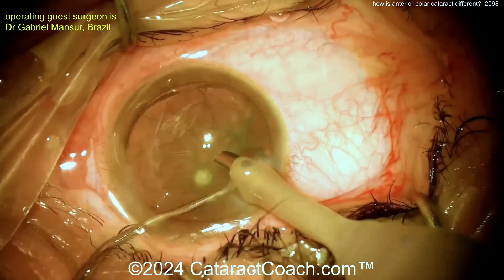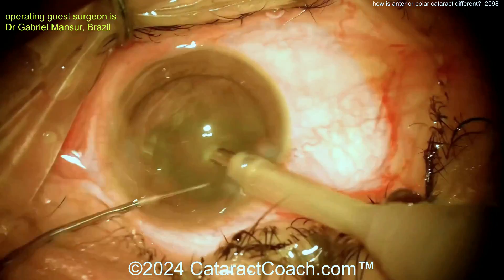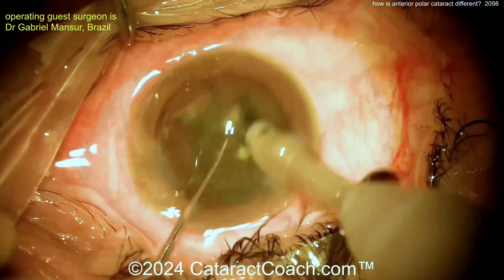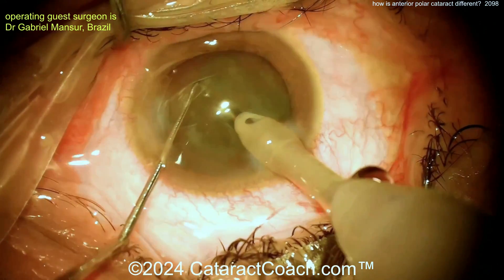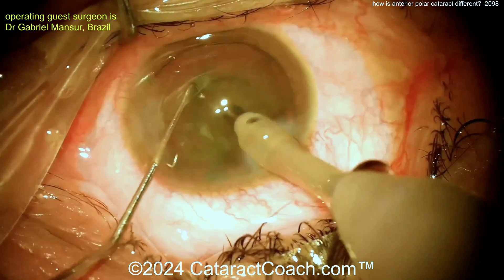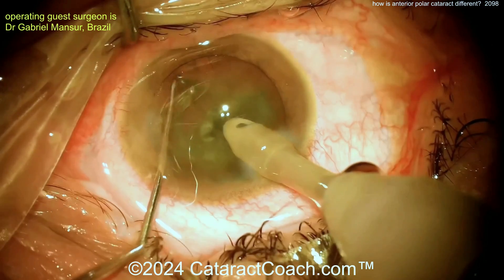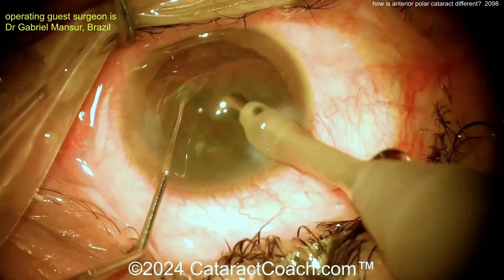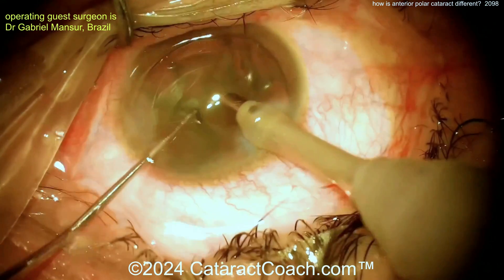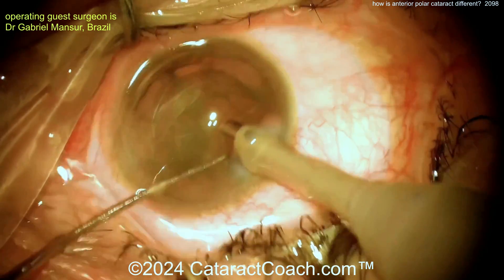Here our surgeon is using a chopper to get the lens rotated — very nicely done. Now buzzing of the phaco probe, chopper going around the equator, horizontal chop — beautiful chop, very nicely done. And another chop, very nicely done. Fantastic technique here. The bottom line is that an anterior polar cataract is not associated with any higher risk of capsule rupture, because that weak spot in the anterior lens capsule is being removed within the rhexis, making it pretty straightforward.